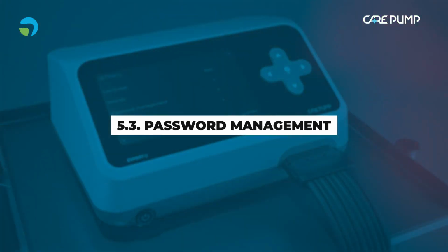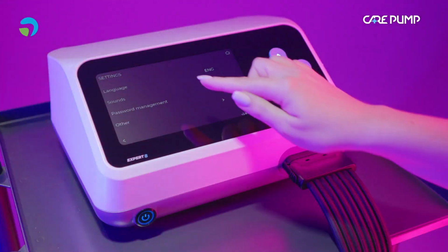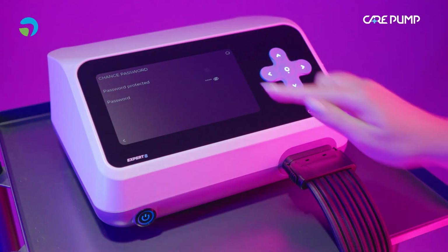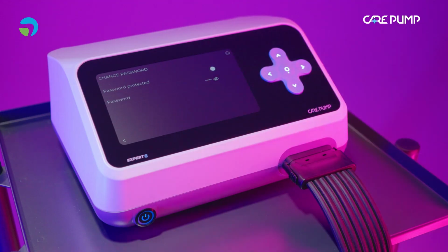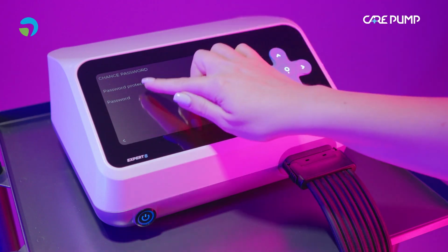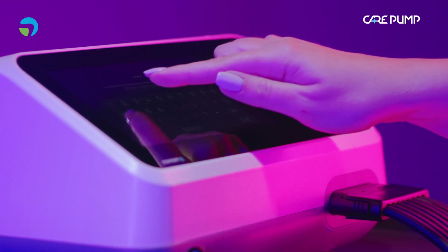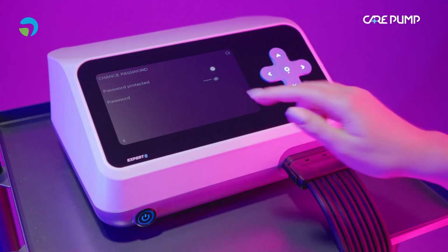Password management. Password management function allows you to set, change, and disable a password that protects the device against unauthorized users. To enable password protection, touch the button next to Password Management icon. Select Password Protected option and set it using the keyboard that appears on the screen. Confirm it with OK button.